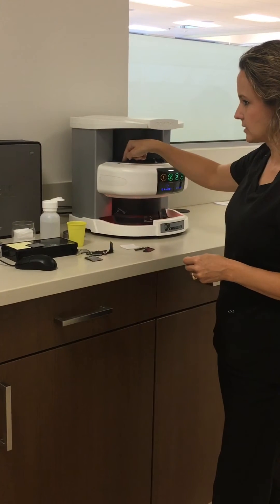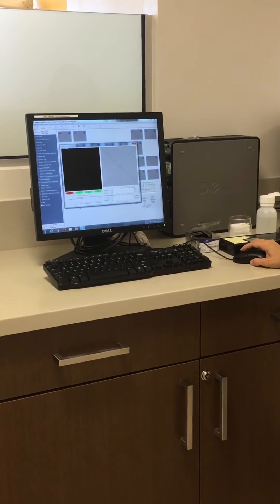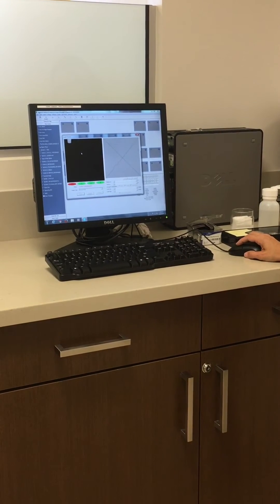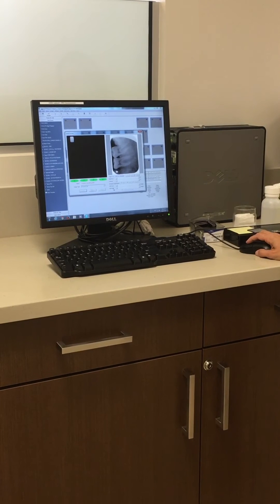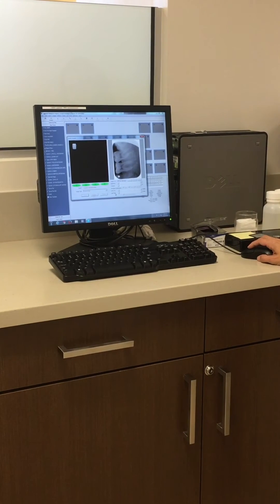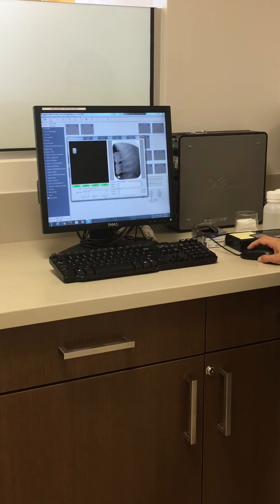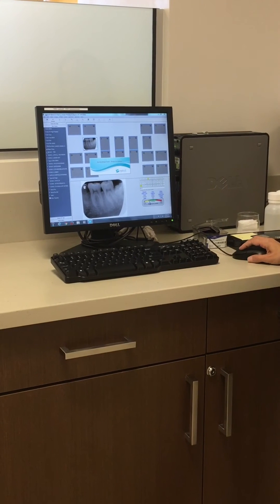The ScanX is ready. Scan in the retake plate. You can see the image coming down into the preview box. It takes just a few seconds and it needs to reach a certain point before it allows you to click Finish. Once finished, the retake image is in its own template.